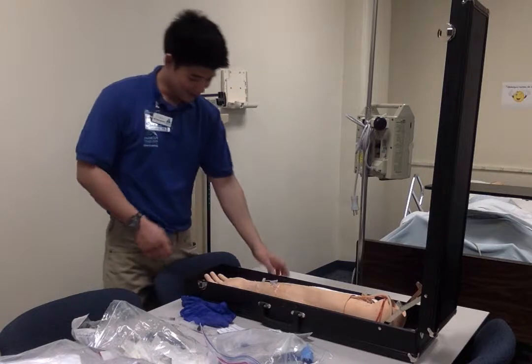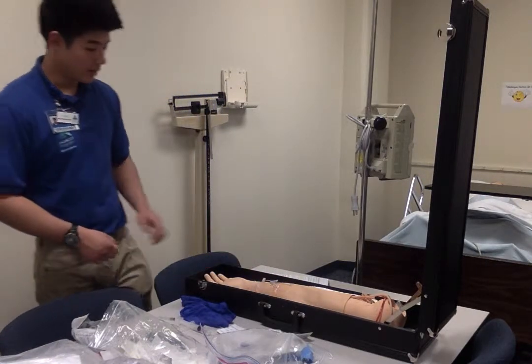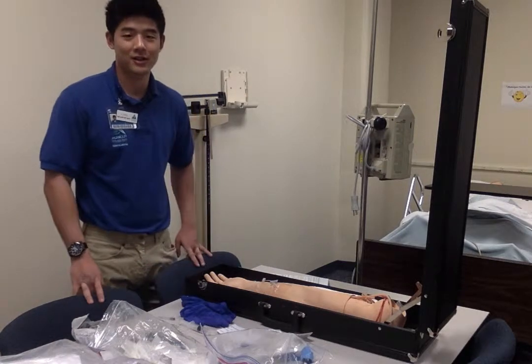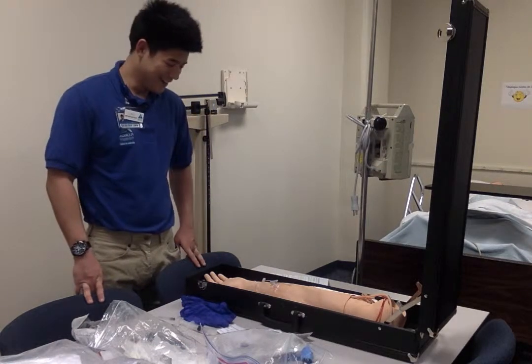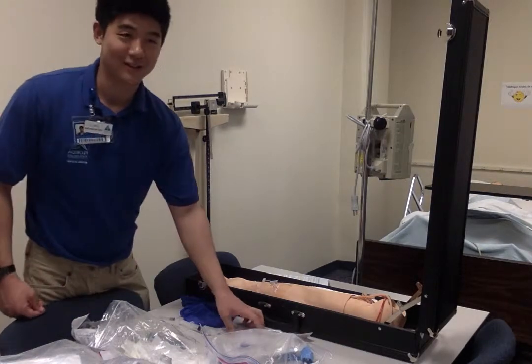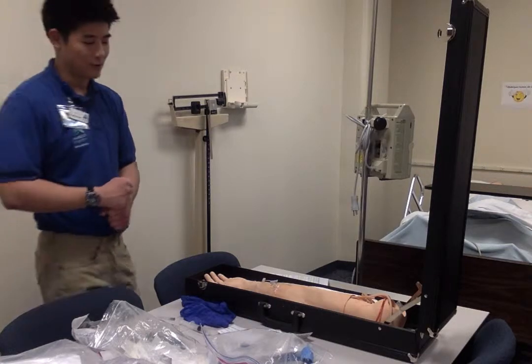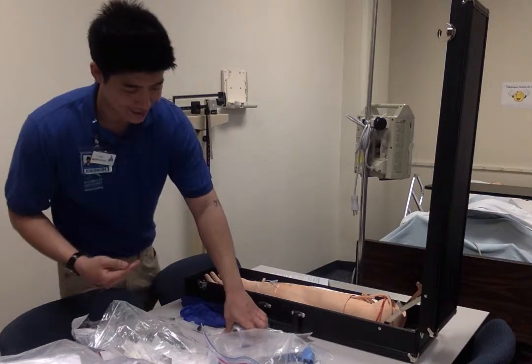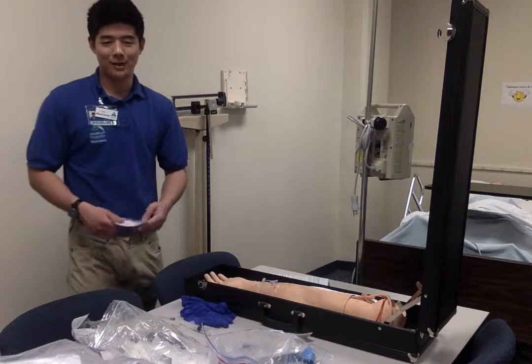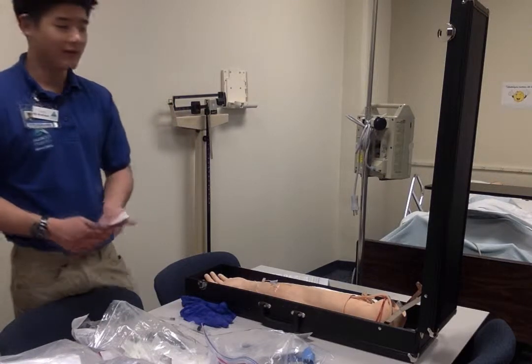Okay. So, doing my second video out of 4. This is my administering IV medication via mini bag. Alright. First thing is you always have to check the doctor's orders. So, always want to double check and make sure that it is the right dosage and right patient. And what I'm doing today for meds is vancomycin.